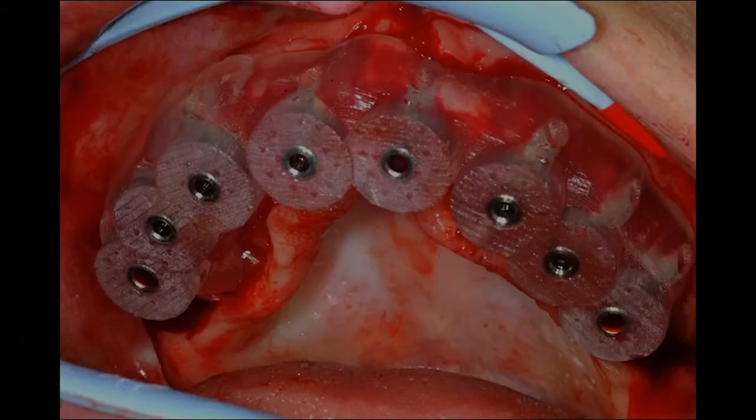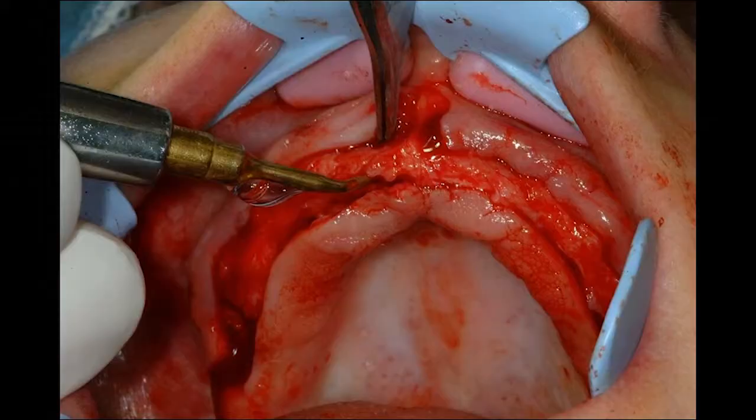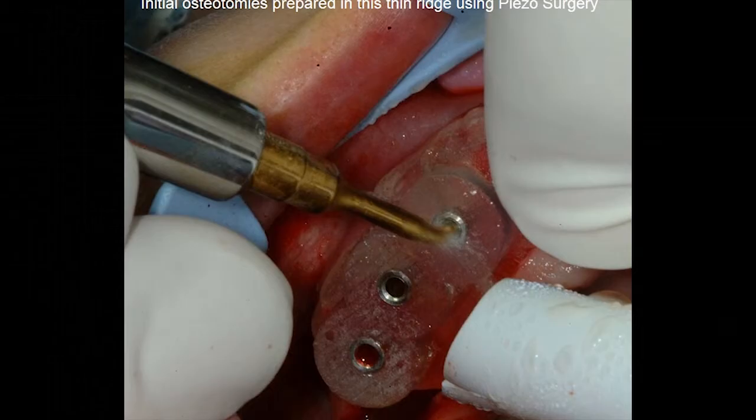Here's the final. Here's the case in the mouth. I think that's a mirror image of it. But you can see there's where our solder joint is right there. So, and there's the final deal seated on that side. Her existing upper. And look, she's just excited as hell to have the security. You notice that her palate's covered, so it wasn't about having a palateless prosthesis.